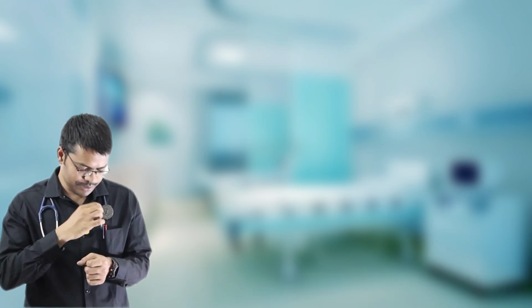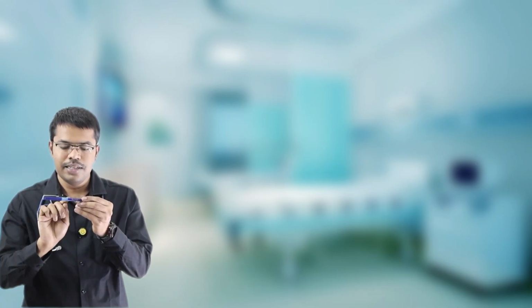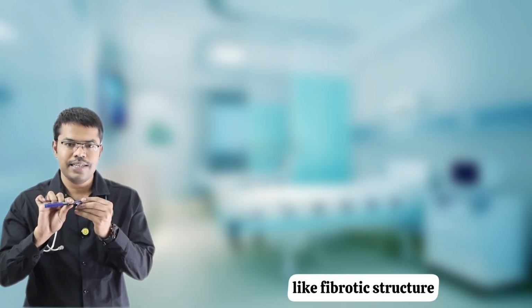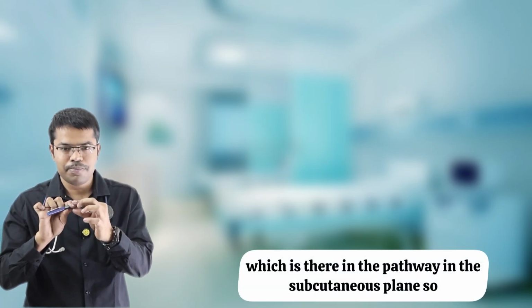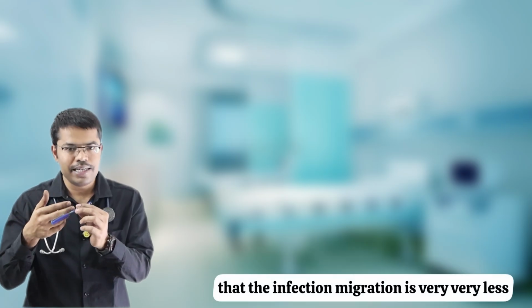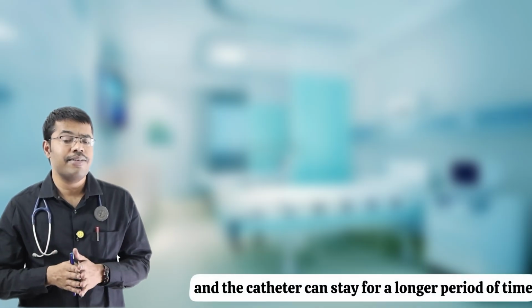A subcutaneous cuff will be there. The cuff is nothing but, let us take this as a catheter, there will be some thickened, fibrotic-like structure in the pathway in the subcutaneous plane, so that the infection migration is very less. So the chances of infection are less and the catheter can stay for a longer period of time.